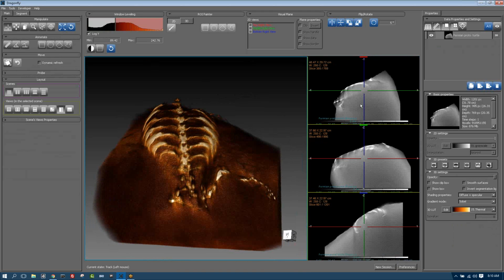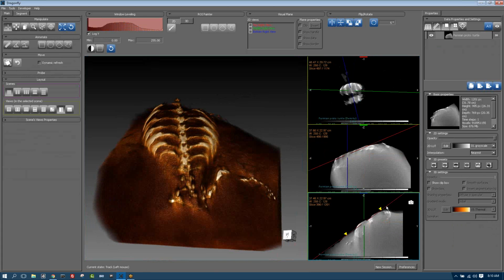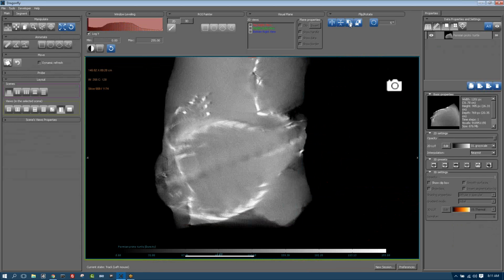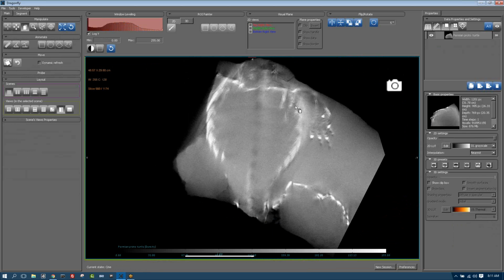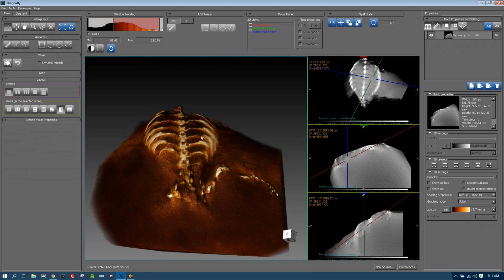But you can see that the bone is still in rock, and so if you wanted to do the segmentation, this allows you to do, effectively, your virtual excavation directly inside the 3D data. So it's very easy to set the plane you want. So for example, if I wanted to tip this plane here in this view, but also tip it in this view, and then now in this view, you can see that I can scroll through and get a very easy orientation for doing my segmentation. So I could pop this screen open, and we could rotate it a little bit, and we could proceed with doing some segmentation here. Now, I'm not going to do any segmentation on this data set. I think we've already seen enough about that.